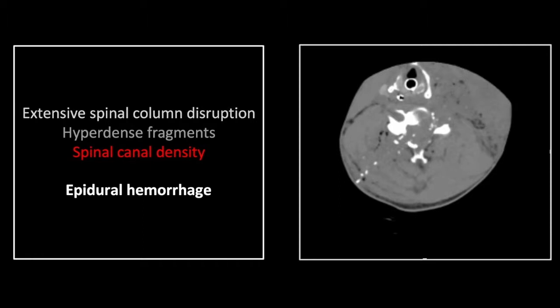You can see this is a gunshot wound. There is extensive spinal column disruption. There are numerous hyperdense fragments, a combination of both bone and bullet, and there is significant increased density within the spinal canal itself. It's easy enough to infer the presence of a significant cord injury as well as extensive canal hemorrhage at this particular level.